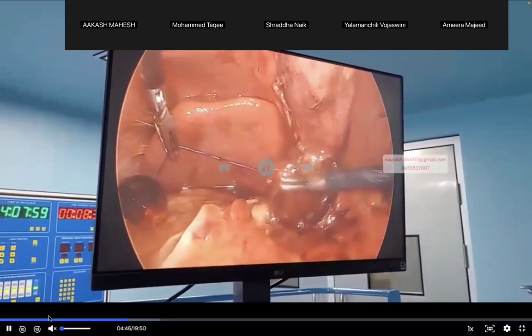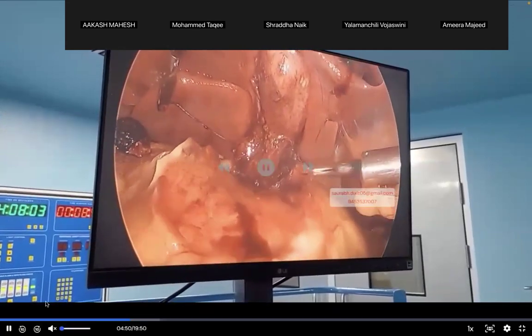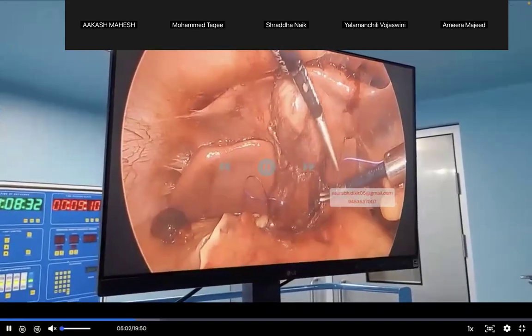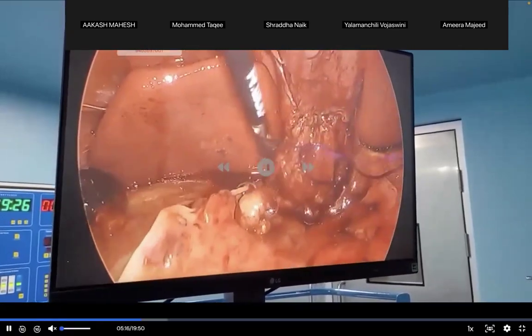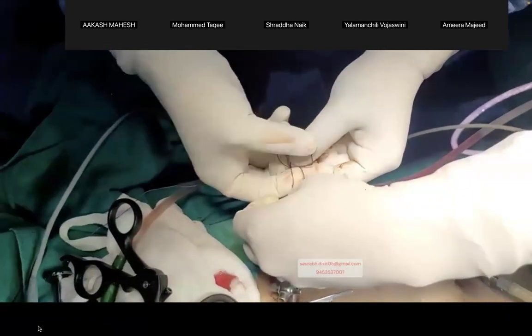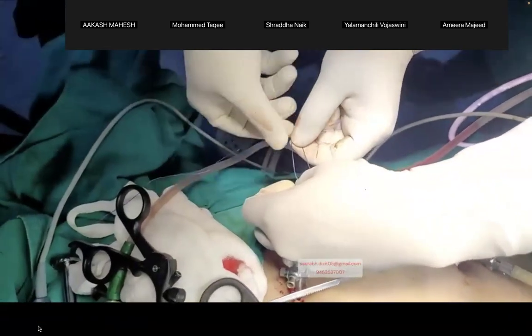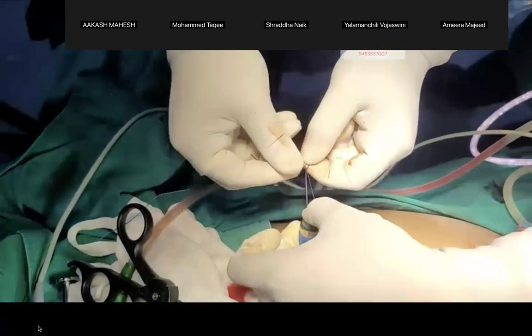The next is I will take this suture out. But before taking this suture out, you need to feed the extra length of suture inside. Just see, I have put a lot of suture. Now I will take this suture out. Now when it is out, the next step is to tie a knot. This is a SurgeryDada's knot or SD's knot where I've taken two hitches. Can you see I've taken two hitches? Next is I will take two winds.